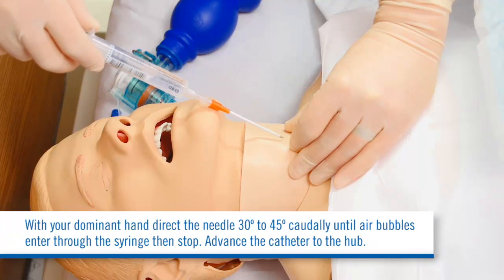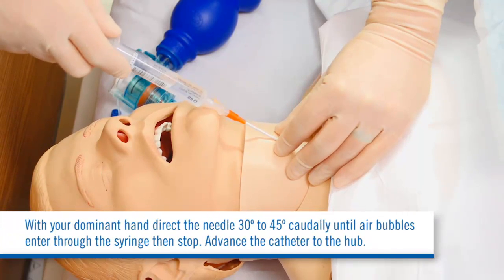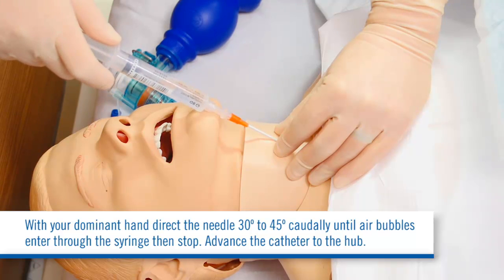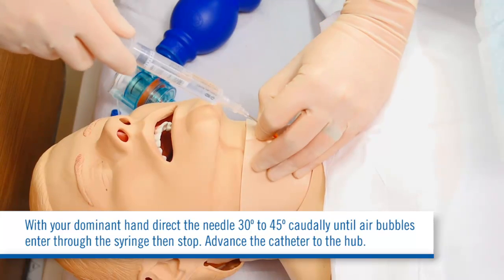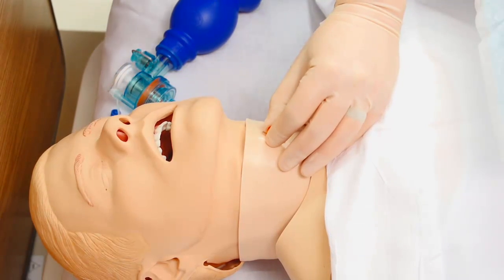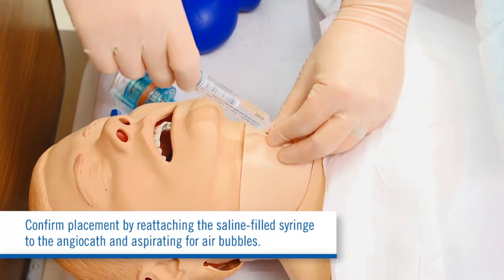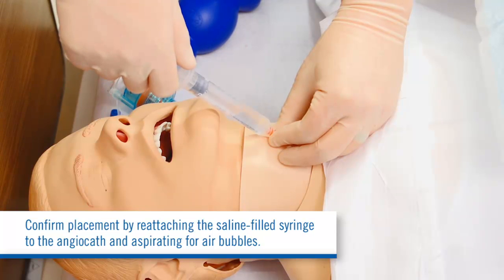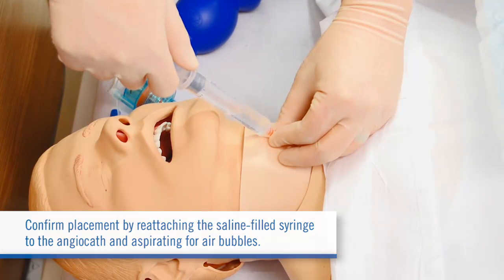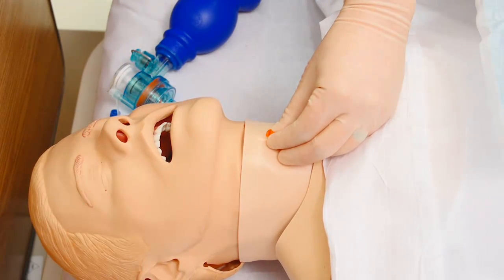With your dominant hand, direct the needle 30 to 45 degrees caudally until air bubbles enter through the syringe. Stop. Advance the catheter to the hub. Confirm placement by reattaching the saline-filled syringe to the angiocath and aspirating for air bubbles. Then, attach one of your three setups.